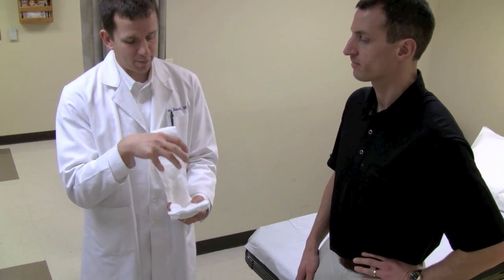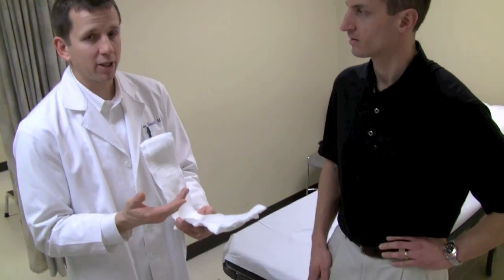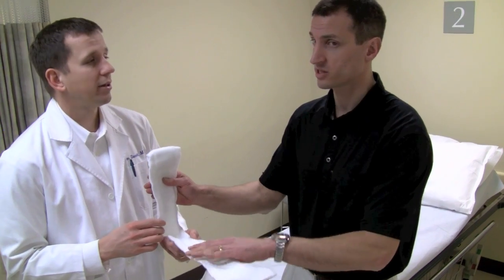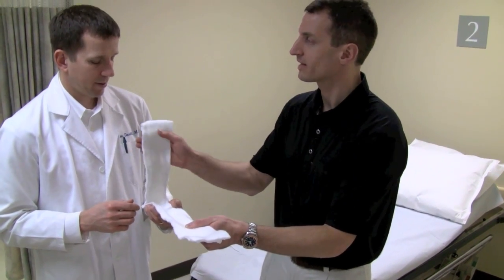What that tends to do is bunch the cotton up in the front of the ankle, and they can get a pretty bad ulcer over the top there, particularly if they swell a lot. So if we're going to wrap the foot, you want to have it in the correct position first and splint it there. Don't start tipped down and then push it back.